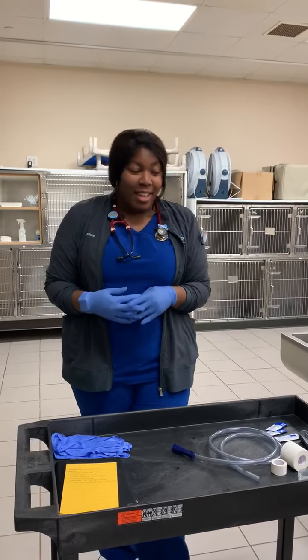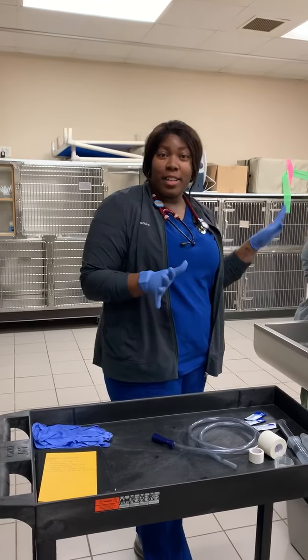Alright, hi, my name is Tiara and today we will be doing an oral gastric intubation here.